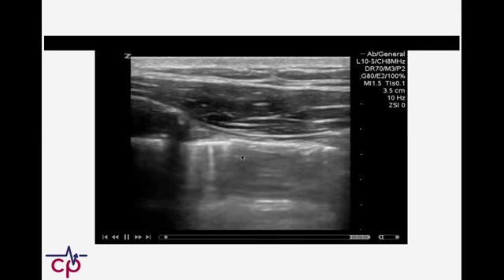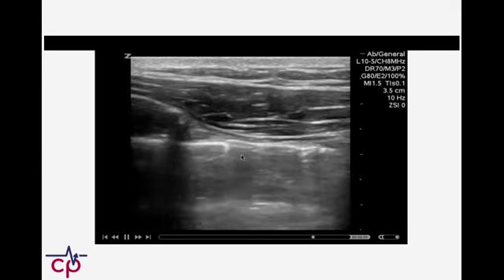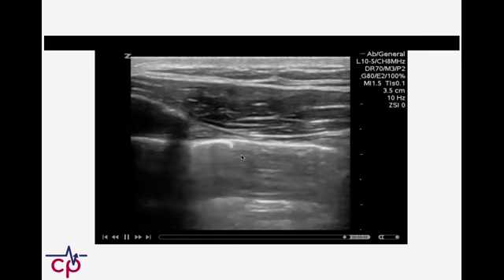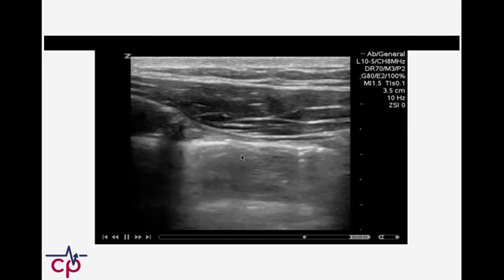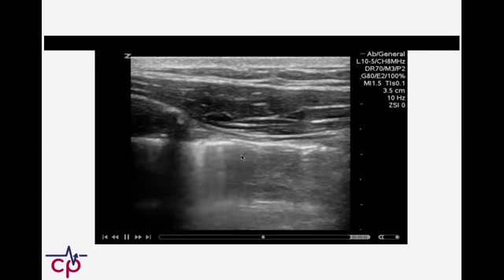If you find this in a given image, then you can find it maybe in another part of the chest. You can get a rough estimate of how big the pneumothorax is. I should say I'm always getting a chest x-ray when I'm doing these kinds of exams and I'm concerned there may be a pneumothorax, because this really is not going to be clinically delineating the size for me on 99% of patients.